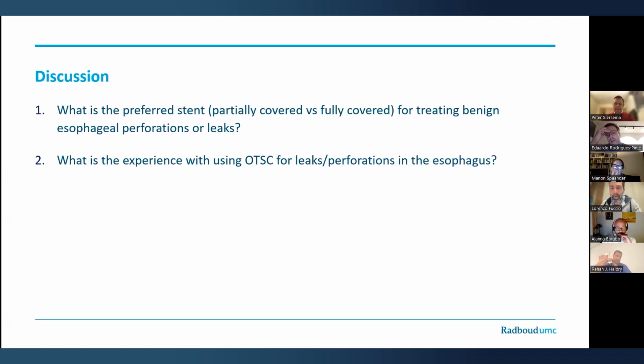Yeah, I agree with that. Eduardo, what are the options when we make a perforation? It's one of the questions from the audience. What are the treatment options in a patient with achalasia that has been dilated with pneumatic dilation and develops a perforation?